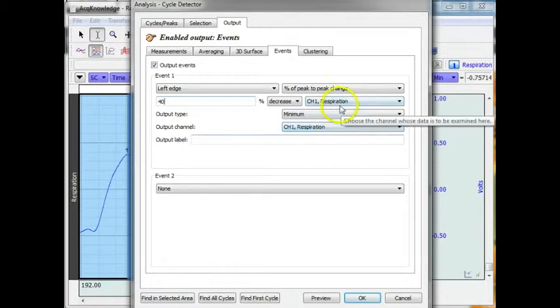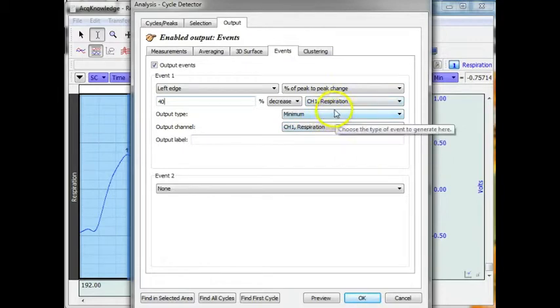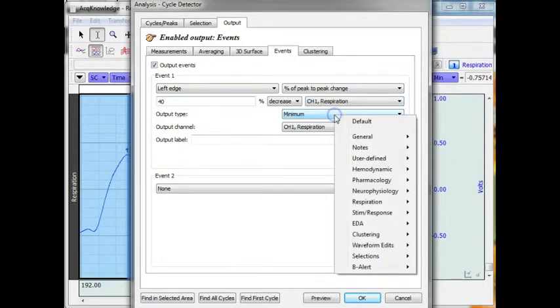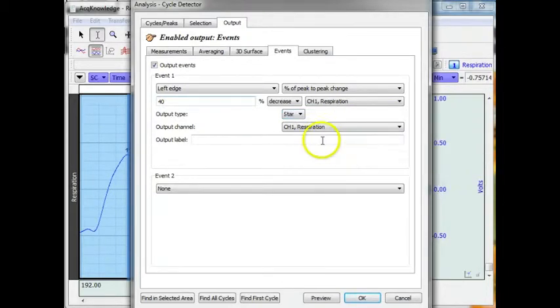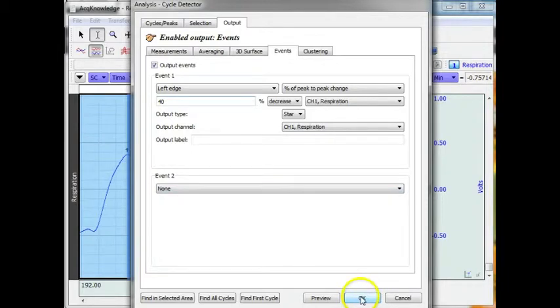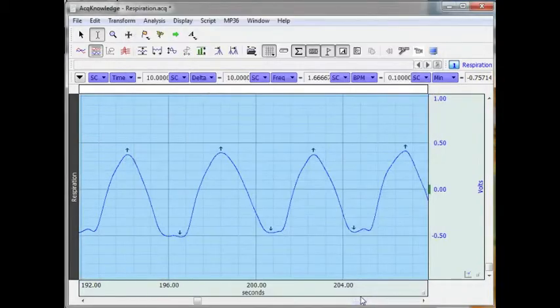And I am going to mark it with a star. I am going to mark it on the respiration signal. I am going to hit OK.